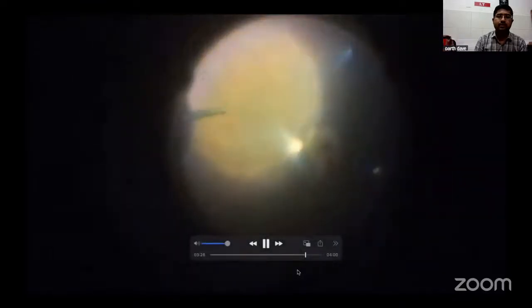If required, if you want to do base dissection in a phakic patient, you can always switch to air and use the pneumatic lift to do the base dissection with a little bit of safety. I do fluid air exchange, and I always wait for 1 or 2 minutes and again aspirate the trickle fluid from the disc. But generally, in normal cases, I do not aspirate or dry up the macula, or go ahead with the soft tip to dry up the macula. I wanted to ask the opinion of the panel as well, whether they dry the macula every time or not.